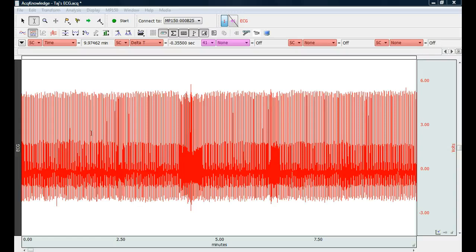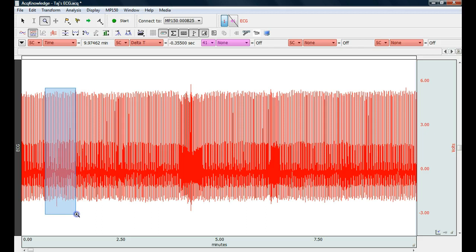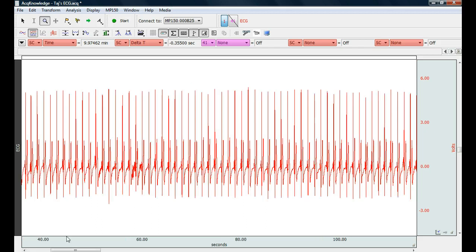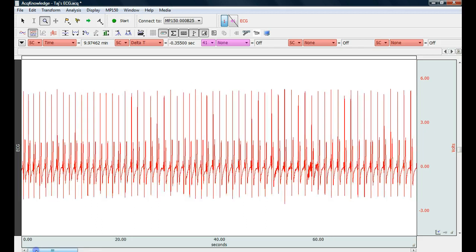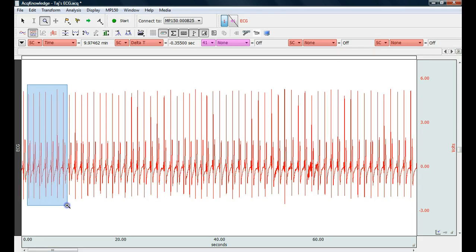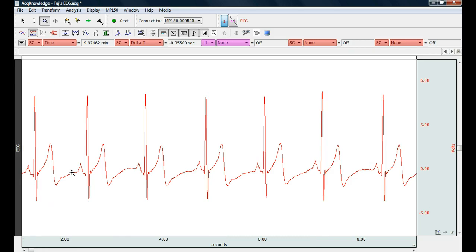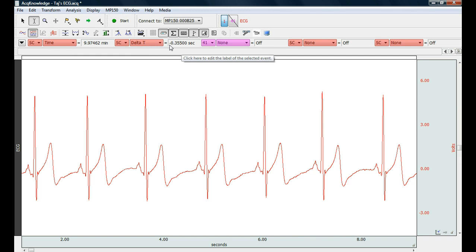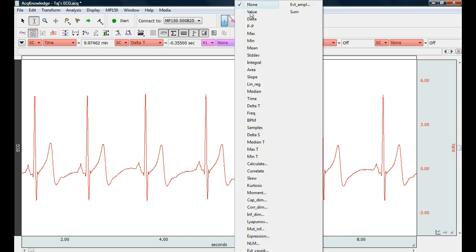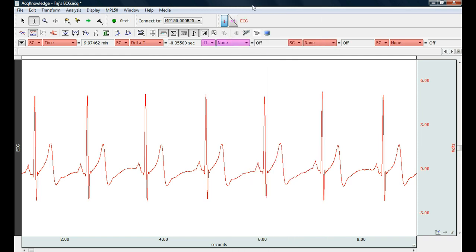So the first thing we do is we open up our ECG file. Let me zoom in on a couple of beats here. Go to the beginning of the file, look at a couple hard beats. I'm going to preset my measurements to time, delta time, and then I'm going to turn all of these off by choosing the first measurement.